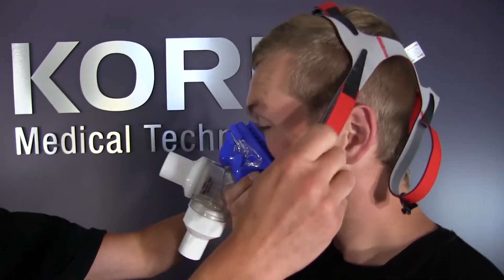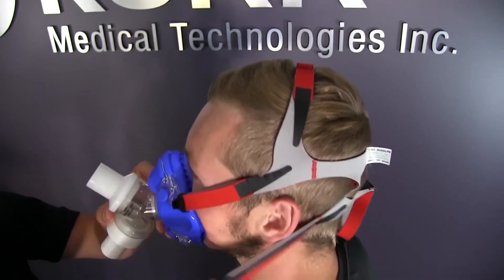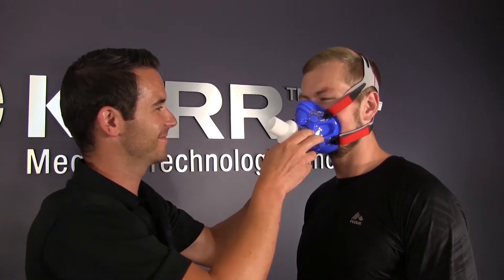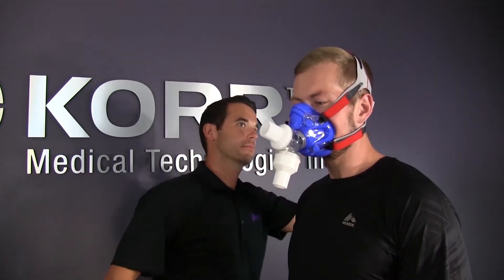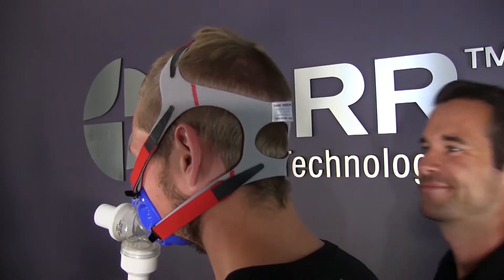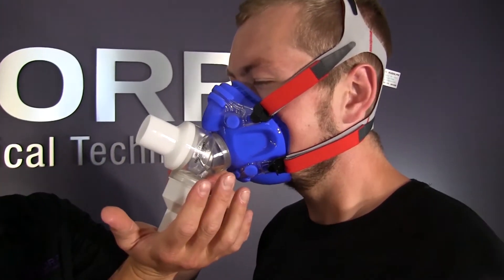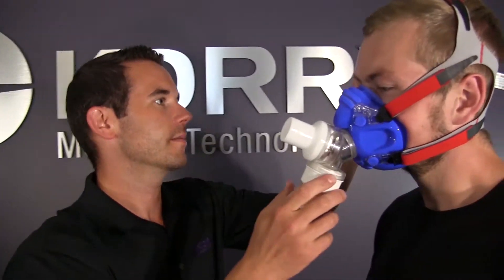Next, attach the headgear. With the neoprene head strap, make sure the gray side faces out. The large opening should fit over the crown of the head with the smaller opening at the base. Clip the straps to the mask and cinch the Velcro until snug but comfortable. Adjust the Velcro straps at the top, sides, and back of the head strap. Check again for air leaks by blocking the expiratory port and having the client blow. If air is escaping, consider either changing the mask or readjusting the Velcro straps for a better fit.